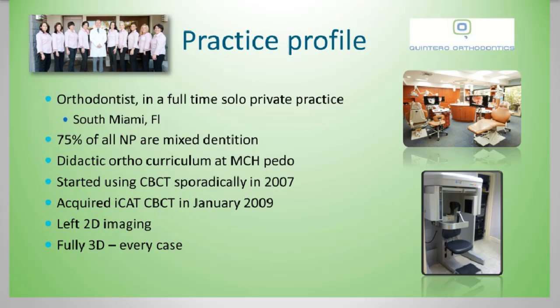So there are many advantages to 3D imaging. First of all, it allows us to see our cases in the third dimension. We are, after all, 3D patients. It allows us to see and understand our patients' anatomy in a distortion-free way, enlargement-free, with no ghosting. Secondly, and as orthodontists this is very important, it allows us to understand our cases in the transverse dimension. It allows us to view the buccolingual dimension of the alveolus, of roots within the alveolus, and how teeth are emerging and fitting within the alveolus. So from a periodontal perspective, that's very helpful.